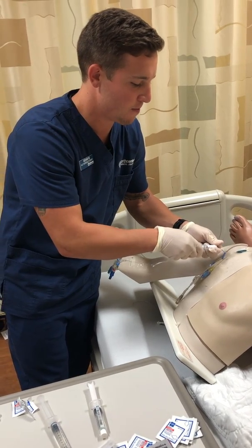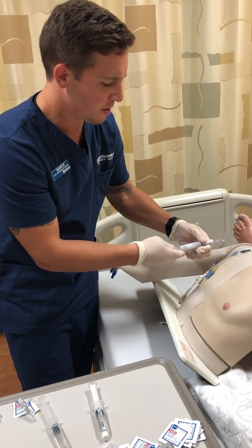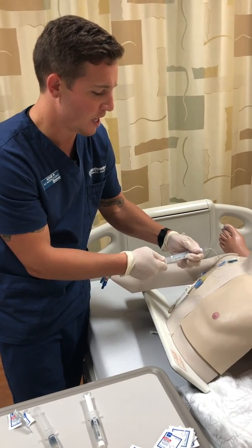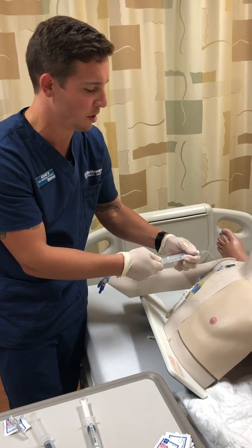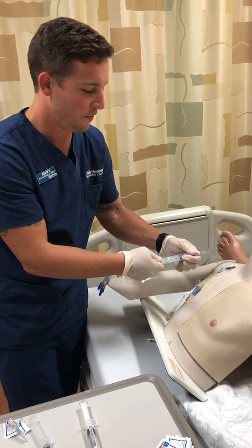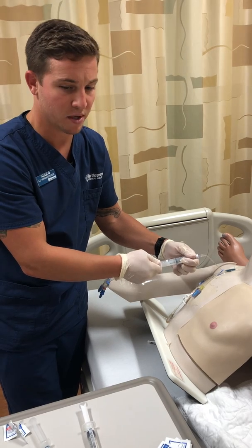Okay, so here is going to draw out. Some considerations here: you only want to pull out as much blood as you need. If your blood draw asks for more than 10 mLs, you're bringing more than one syringe. If you only need 10 mLs, then only get 10 mLs.